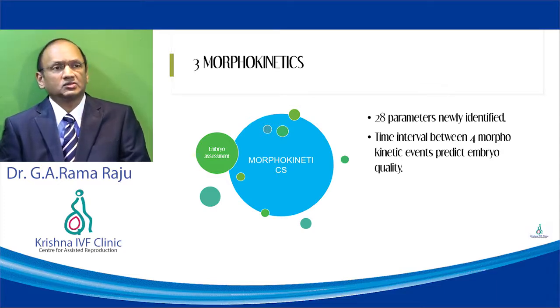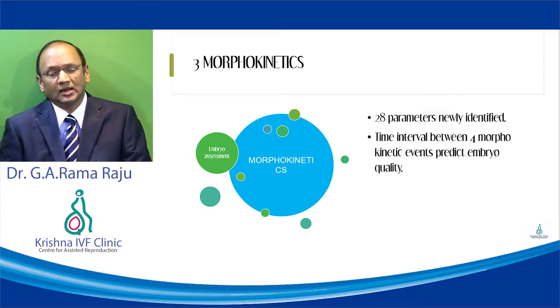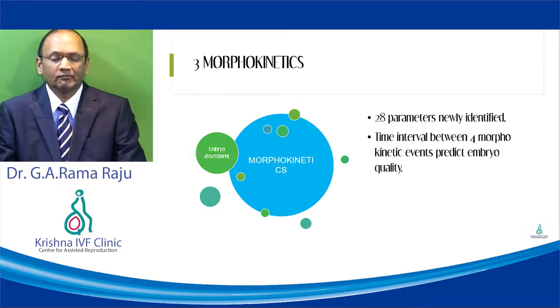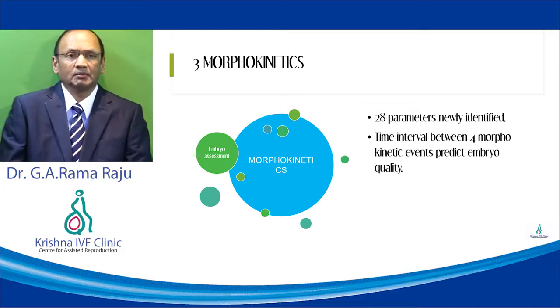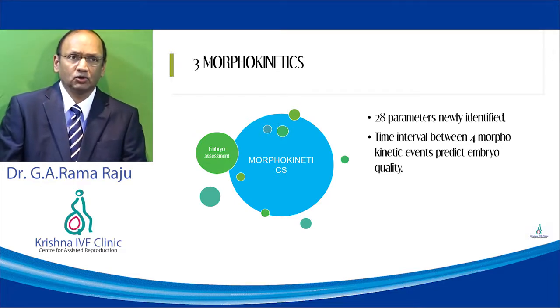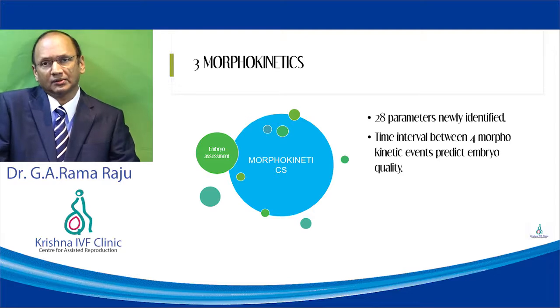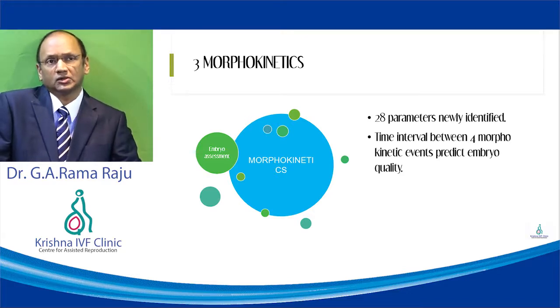These events in the first 24 hours are becoming predictors of the day 3 embryo and the day 5 embryo. So, a time will come at the end of day 1 or day 2, we might have quality information saying these are the embryos which will help us to go to blastocyst, and you can also transfer them on day 3 or day 2 depending on the country laws.